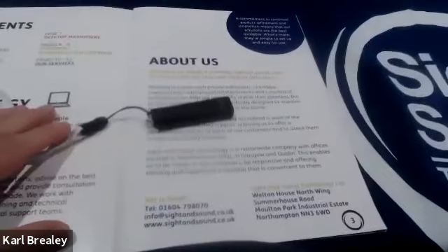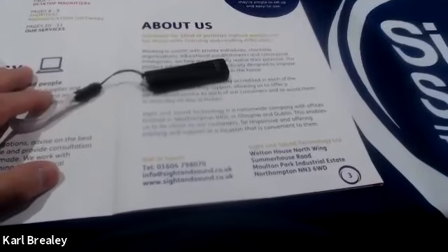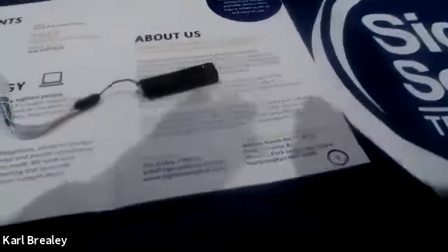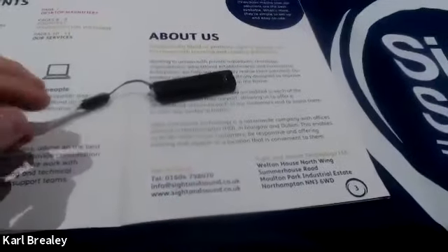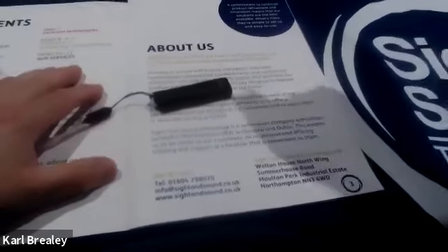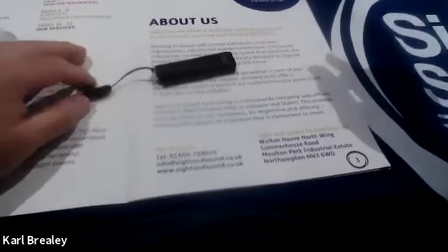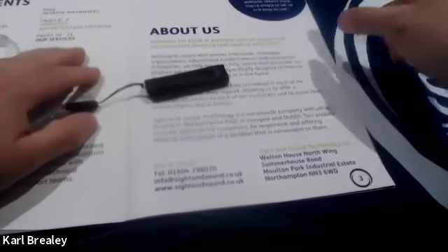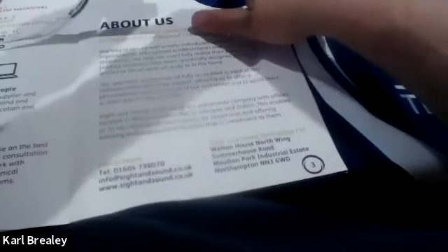That's fine. We'll start with columns. Columns are no issue for it at all. It's bread and butter. Newspapers, hold it up, it knows. They put specific line breaks in to make you aware that it's a different column, and it also enables the camera to realise there's a break. All it has to be is a certain gap, so it knows it's not continuing that sentence. With regards to contrast, it's the same as with some magnifiers. There are some things that it may struggle to read, so I'm just going to see if it will pick this up.